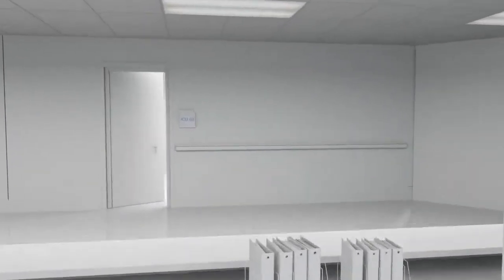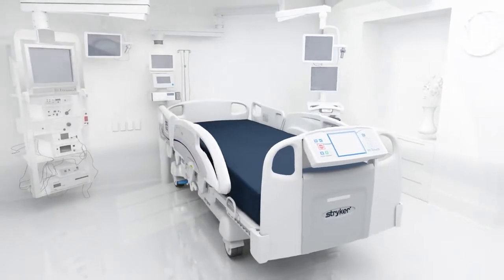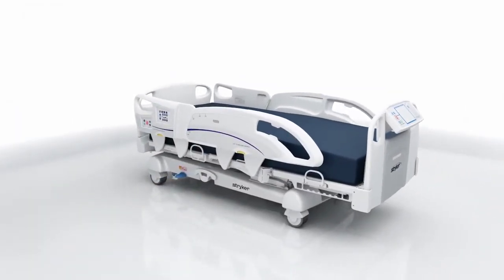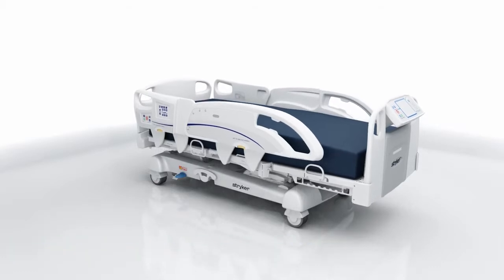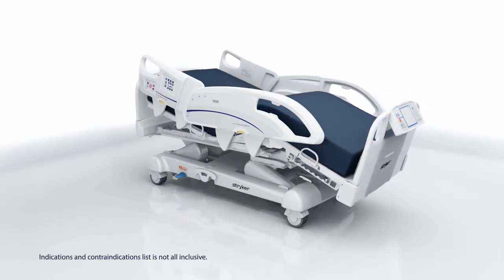Every year, over 1 million people in the United States are admitted to an intensive care unit. These patients often experience prolonged periods of immobility due to the complexity of a critical illness, deep sedation, and perceived barriers to mobility. Early mobility is a term that describes activities related to mobilization, initiated immediately after stabilization of the patient's respiratory and hemodynamic status, within 24 to 48 hours after admission to the ICU.